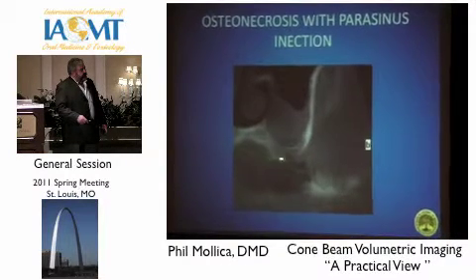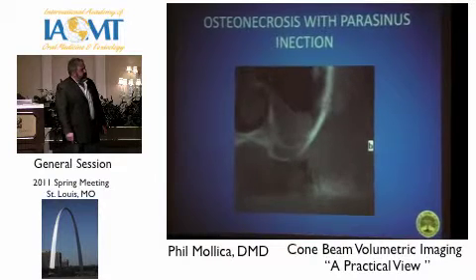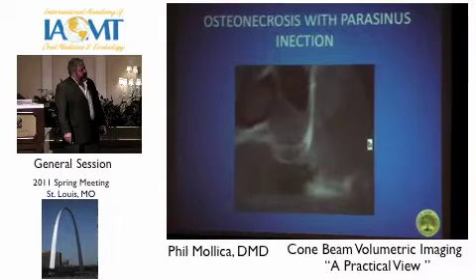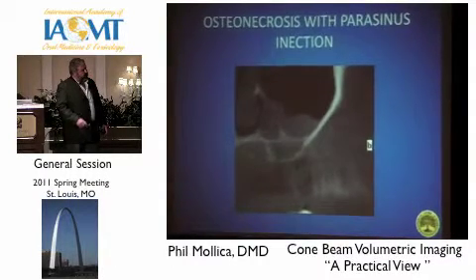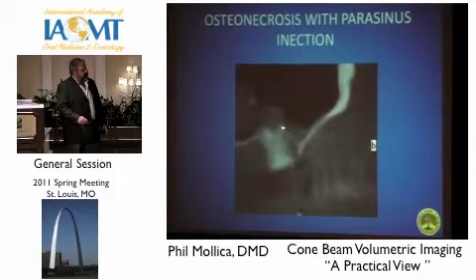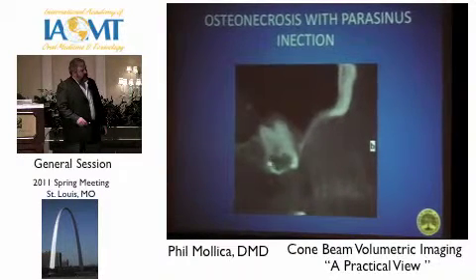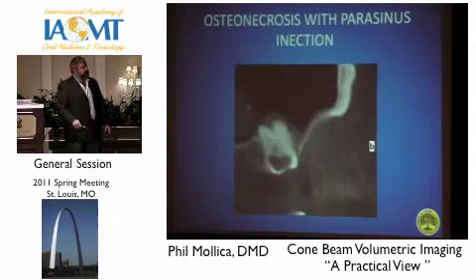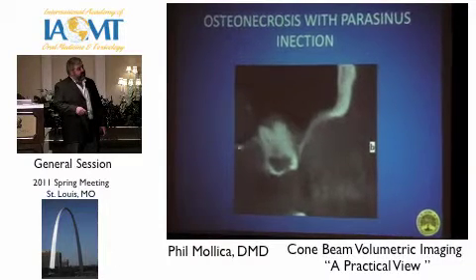Once again, we start to see the bone. The density is very low. We see the parasinus infective components, inflammatory reaction here, working our way further back. Hole in the bone. We start to see the dentition itself, the infection right around the tooth itself. Look at this tooth here. The hole in the tooth. And it's totally submerged under the gum. You wouldn't know it's there. And interestingly enough, this is on his left side. This is all being cleaned up.